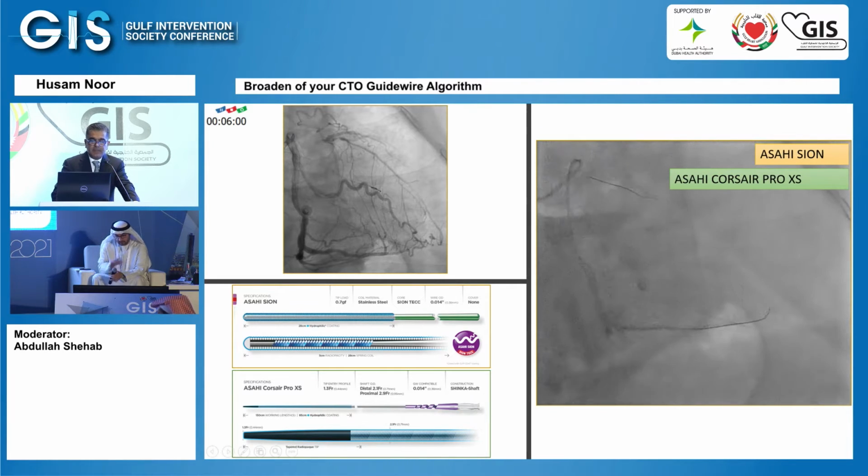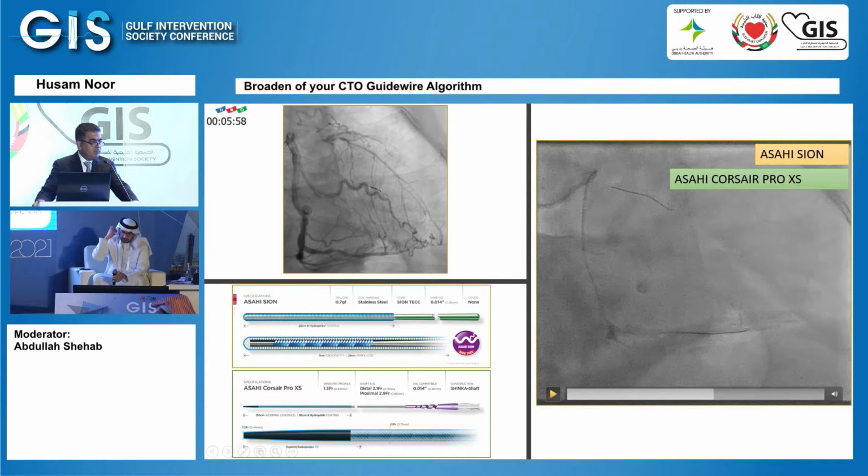So because of the ambiguous cap, lesion length more than 20, calcified tortuosity, and distal cap with multiple branches, and we had good interventional collaterals, we thought it's best to go retrograde so that we would not damage the distal cap, and to solve the ambiguity of the proximal cap.